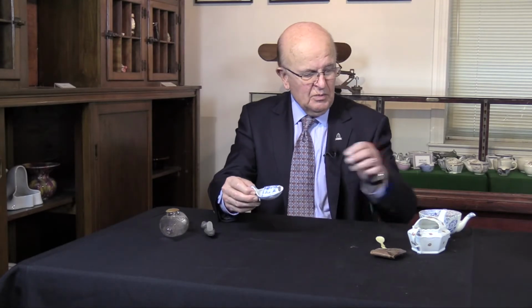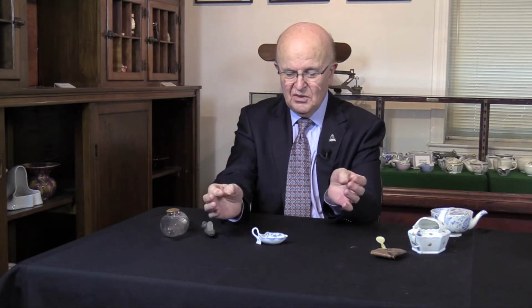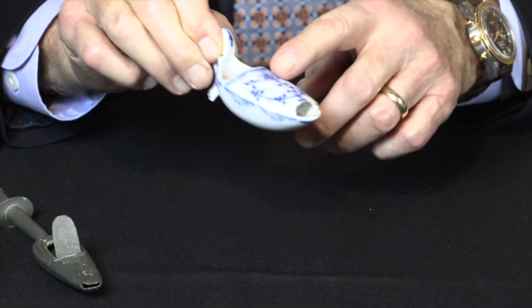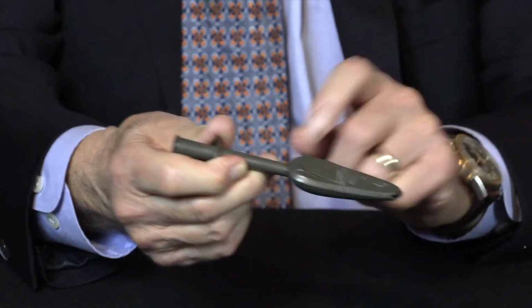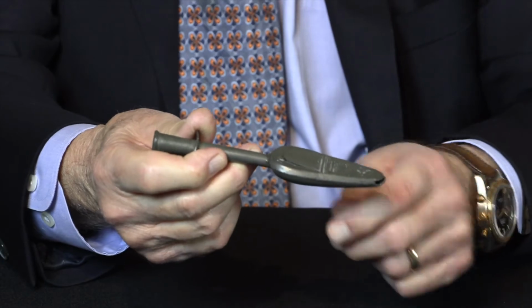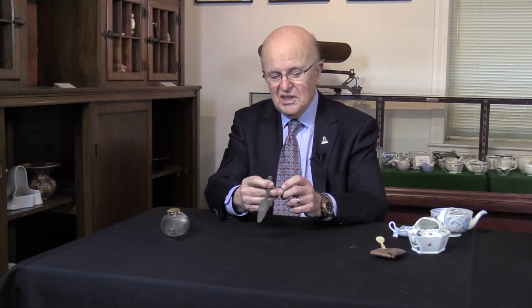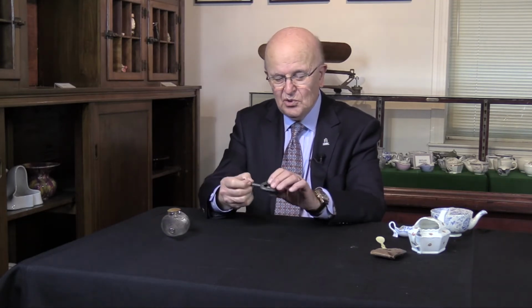Another ornate one that reminds me of this feeder here is another medicine spoon. It has this area to sit flat, and again the patient will suck on the medicine here without smelling it because of this area covering it. One interesting thing is this type of spoon. You put the medicine here, and then you cover the lid here so the patient cannot smell the medicine, and the patient or the child will suck it from here. The curator of the museum here, Ed Zerzak, pointed out to me that the mom will blow air through this, and that will push the medicine to the mouth of the child. I think that's a very, very clever way of doing it.